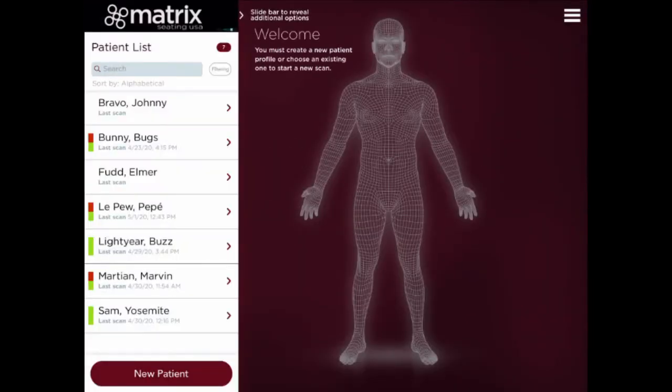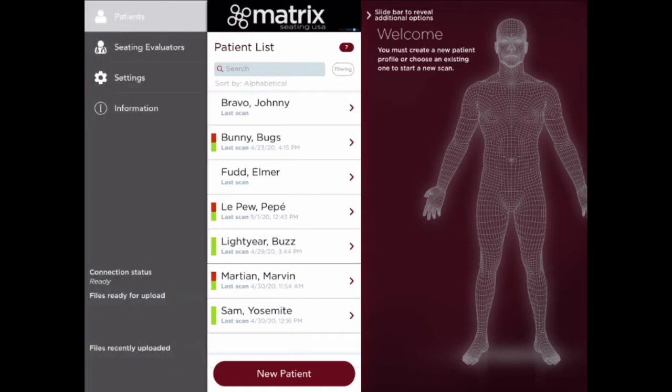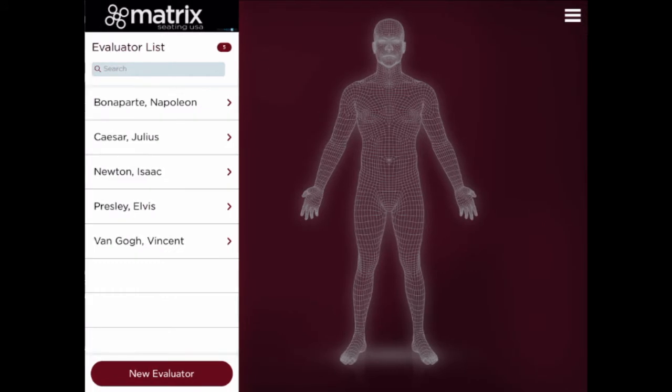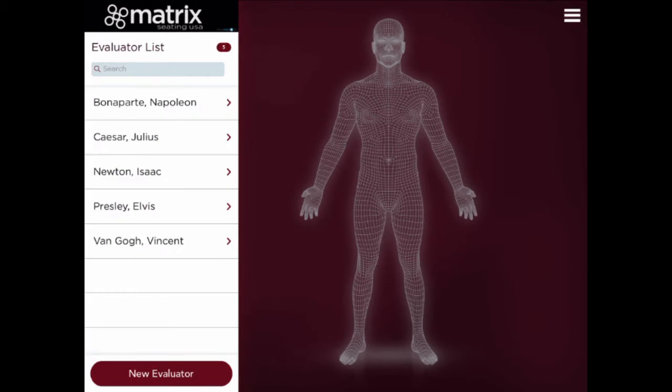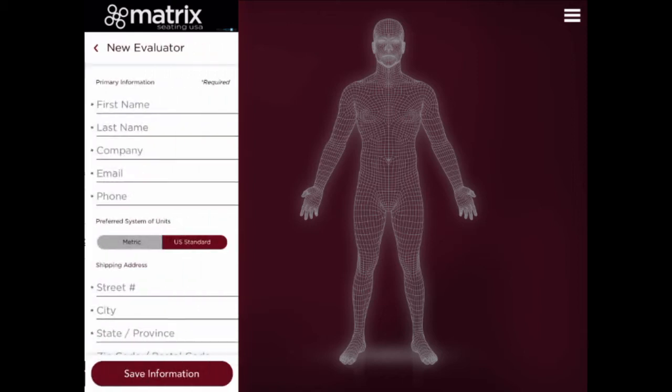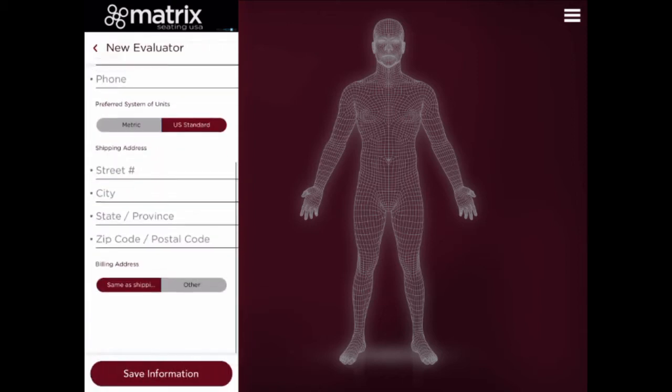First, use the sliding sidebar at the top to reveal the seating evaluators tab. Confirm that your name is on the list of seating evaluators. If it's not, add your name by selecting the New Evaluator button at the bottom of the list. Enter your information and then click Save Information at the bottom of the form.